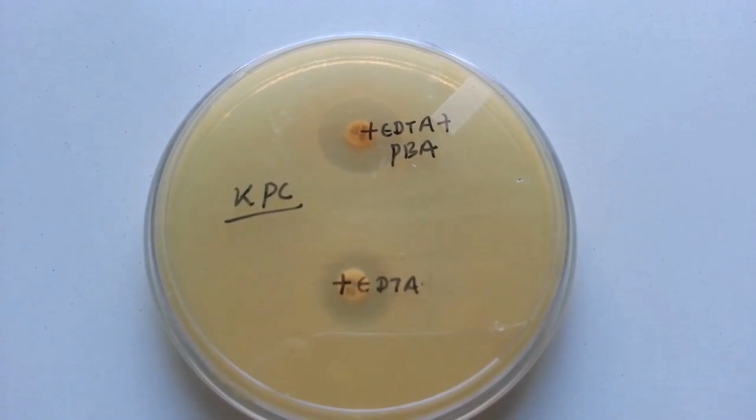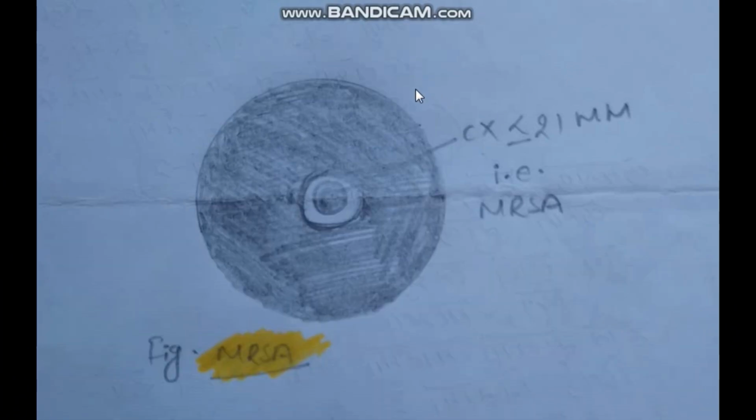Okay, now about methicillin resistant Staphylococcus aureus, in brief MRSA. It is very simple to detect in the laboratory. This is the Mueller-Hinton agar. The Staphylococcus aureus with a concentration of 0.5 McFarland standard is inoculated and incubated with cefoxitin.